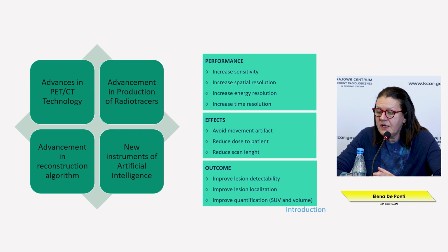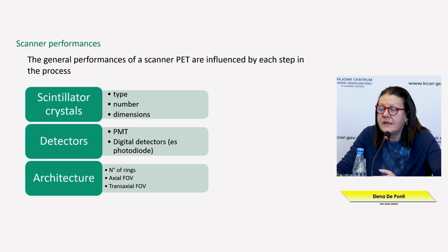As an outcome, we will see better the lesions, and we will see better the small lesions, and also we can improve the lesion localization, and as well we can improve the quantification of such lesions, in particular for the small ones, to be able to identify the different positions of the disease in the patient.